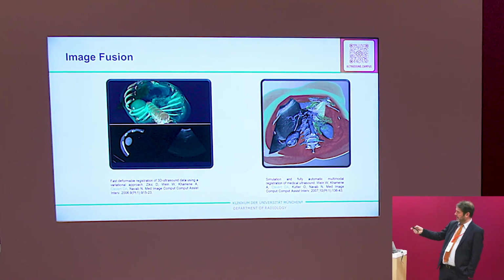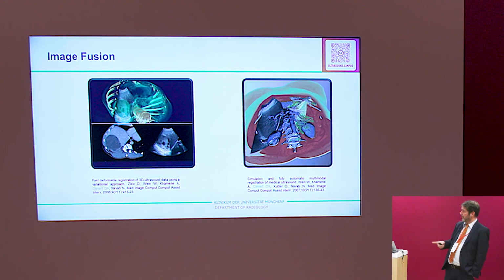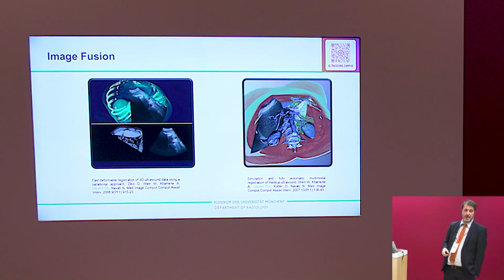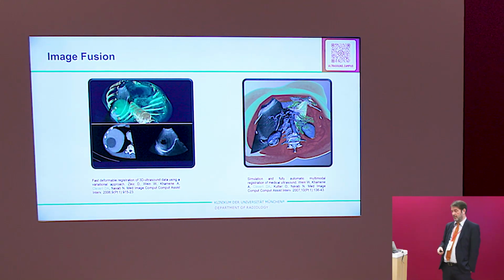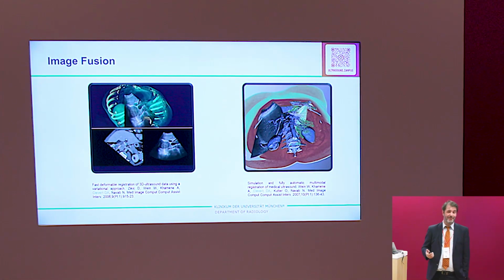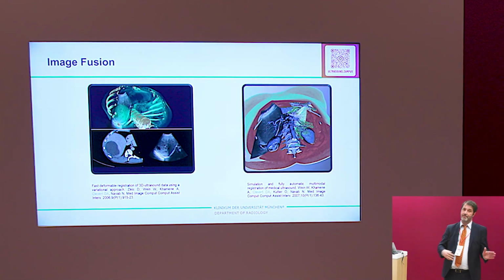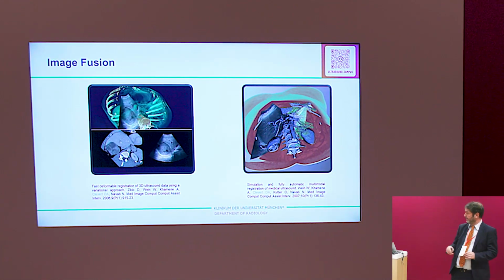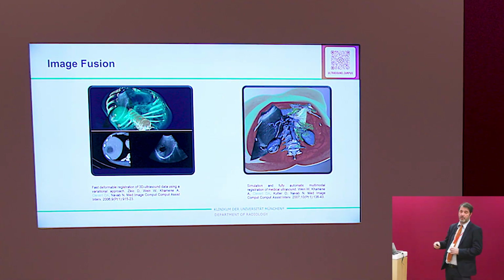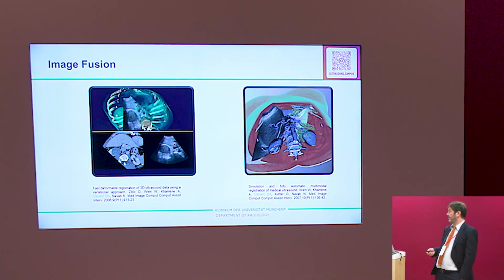But if you see these images over there, they're more than 20 years old. But you see registration, ultrasound and CT, at this time even, it works. We had no bracket for the probe. We used some glue and connected the sensor to the probe. And we also had no patient tracker, so if the patient moved a little bit, we had to start from zero. But even if you look at this paper, which was published in 2006 and 2007, from the data from 2005, it works pretty good.